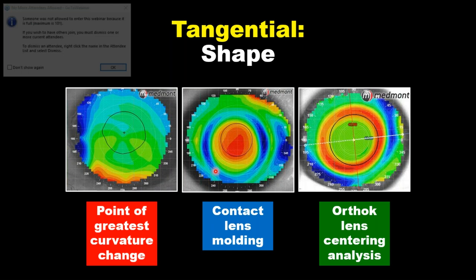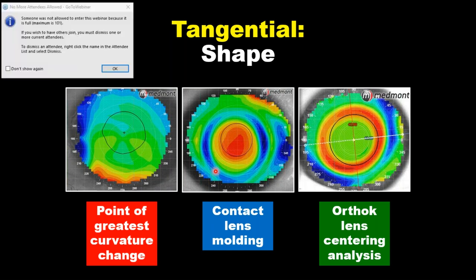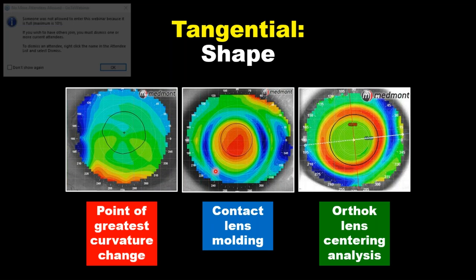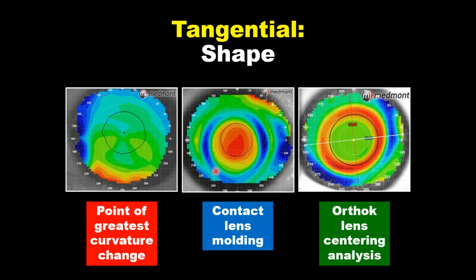El mapa tangencial es capaz de decirnos dónde es el cambio más radical o más curvo, nos da localización, área y severidad — esa es la parte importante. In our middle image we see the bearing of the rigid contact lens — the molding that the rigid contact lens creates on the anterior surface. So the tangential map is describing to us corneal molding.